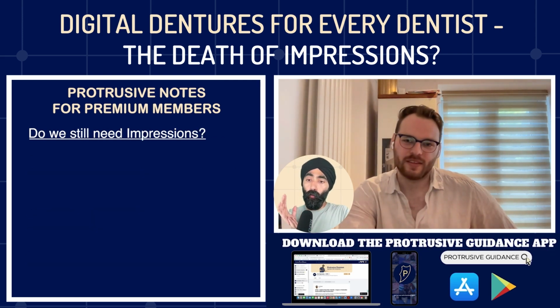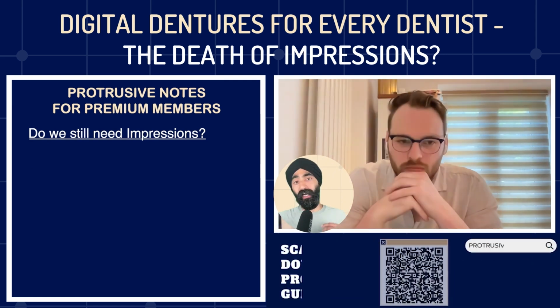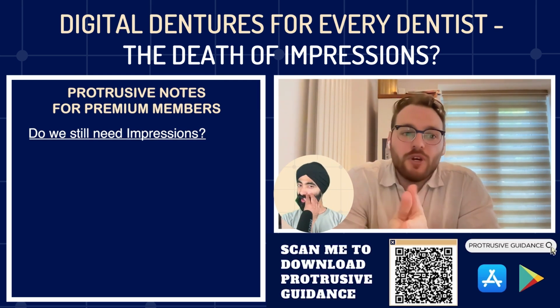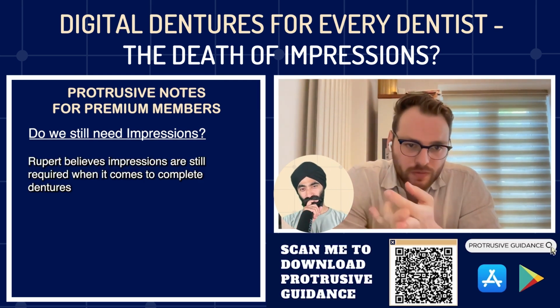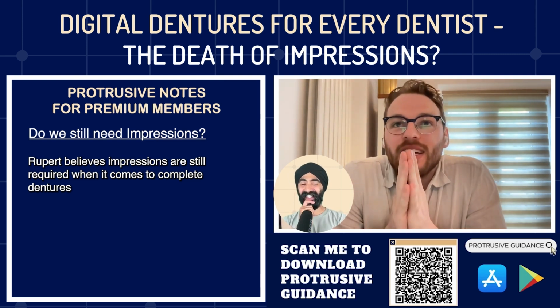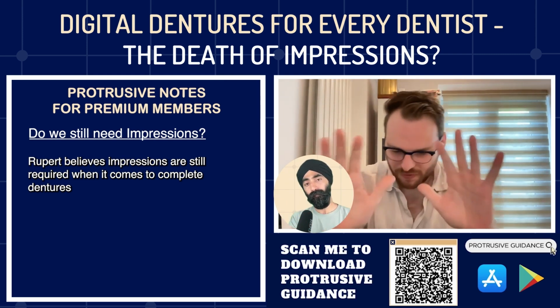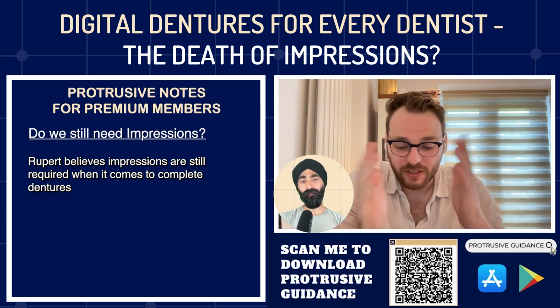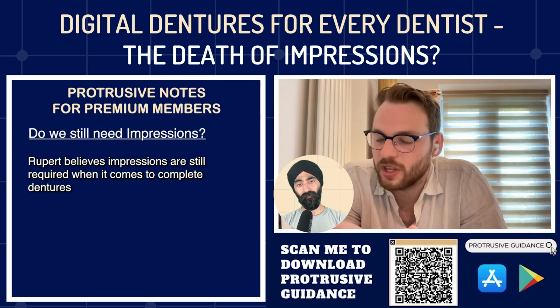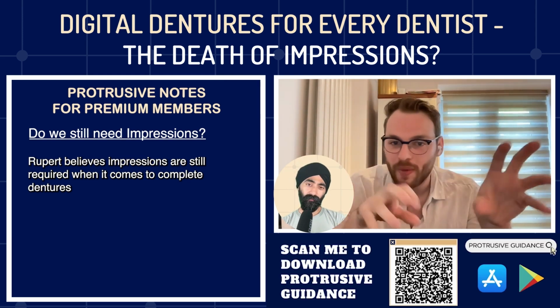What stages or what types of work do we still need impressions for? What, for example, you might say that the secondary impression of this type of denture, where do we still rely on impressions? Fine. So for me personally, in the workflows, complete dentures still needs an impression. Both primary and secondary? So, in terms of primary and secondary, yes, you can do that. Okay, so let's just talk completes for a second, because there's loads. As I say, I mentioned we teach this, and we did a course on this last June or something, and even within the course we worked out like 4 different workflows, because there's just so many areas that you can use.